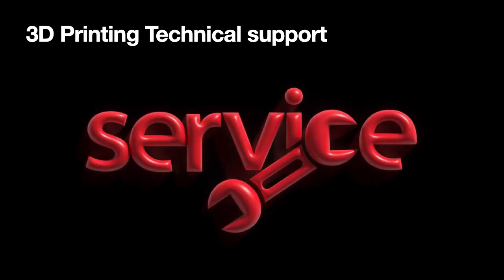Of course, technical support, we all know in digital dentistry, is a huge part of the decision making because there will be hand holding, and there will be issues that will come up. If you don't have a vendor that gives you good service and support, that is a problem. This support could either be online or it could be physical at your office. You need to consider that. Also, in terms of the cost of the machine, you need to add the cost of the support, whether there is a monthly fee, annual fee, quarterly fee, or whether it is free. That's something you need to know upfront because that will also add to your cost of ownership. So service is an important part, and please do consider this.